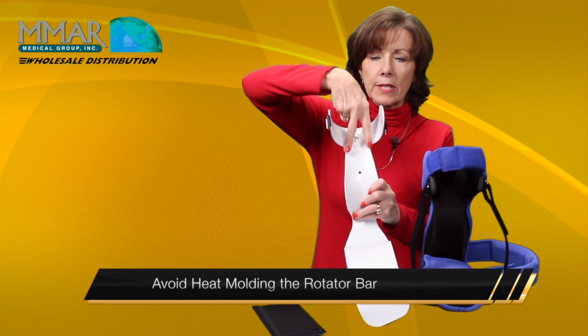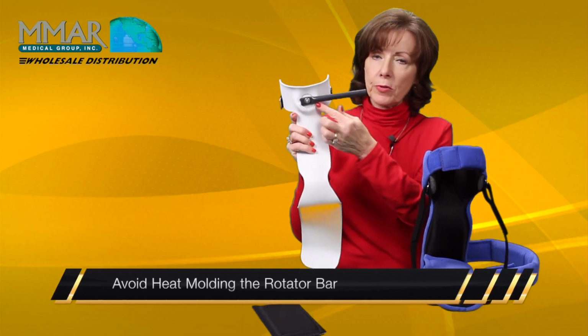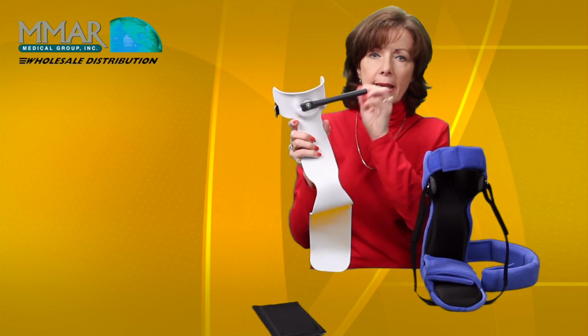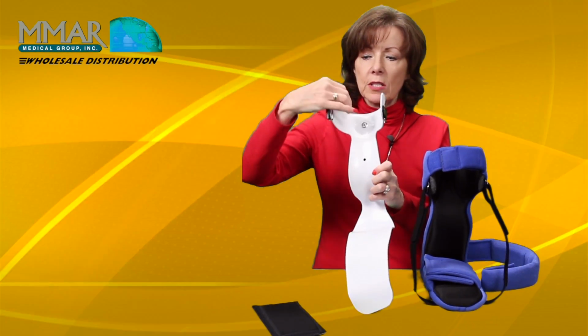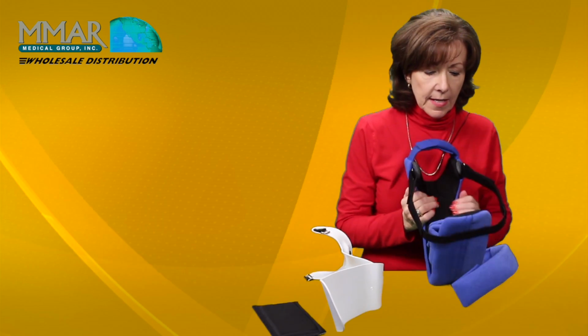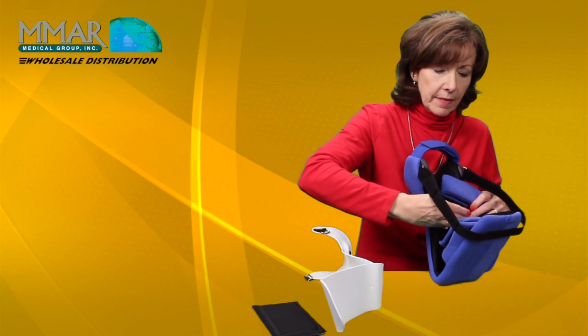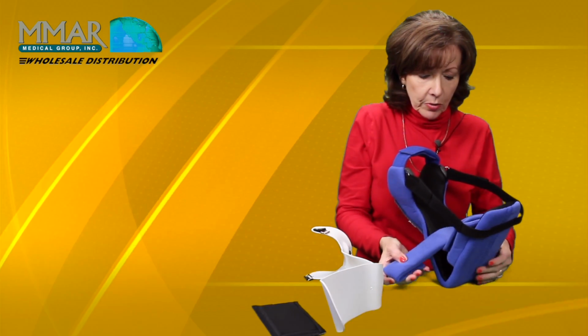Don't heat mold any in here, because this is designed to hold the rotator bar, and if you soften that plastic, it will lose that shape. So just bring the wings out a little bit. Okay, now you're going to make sure that heel is down in the boot. I'm going to wrap this around.